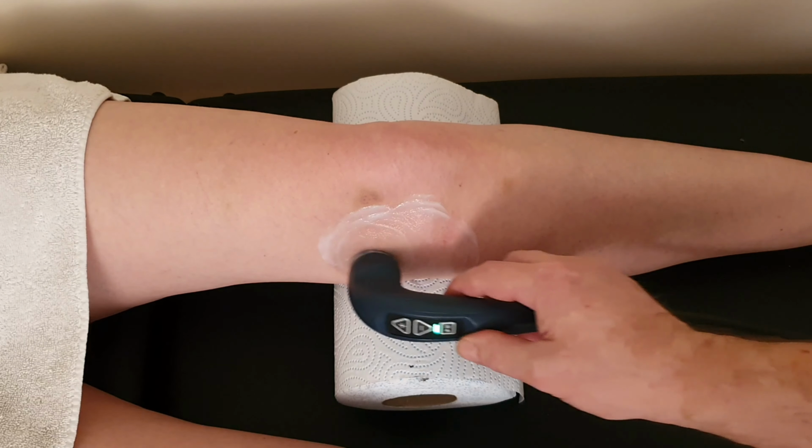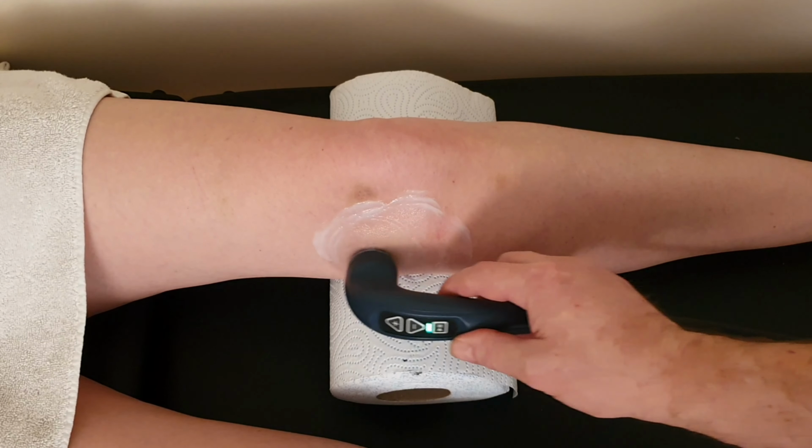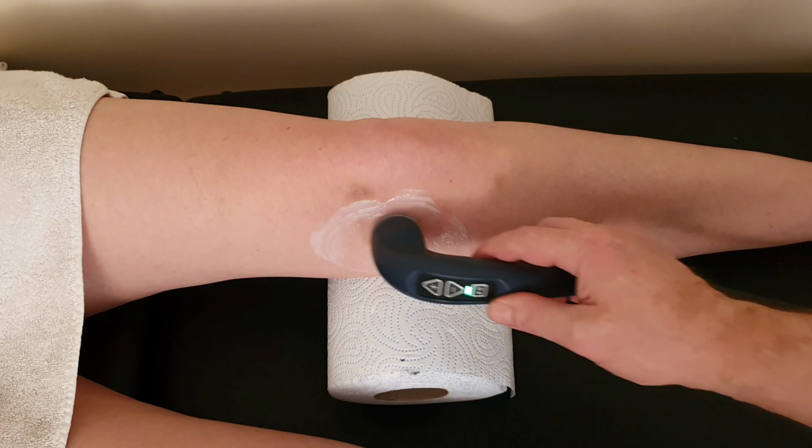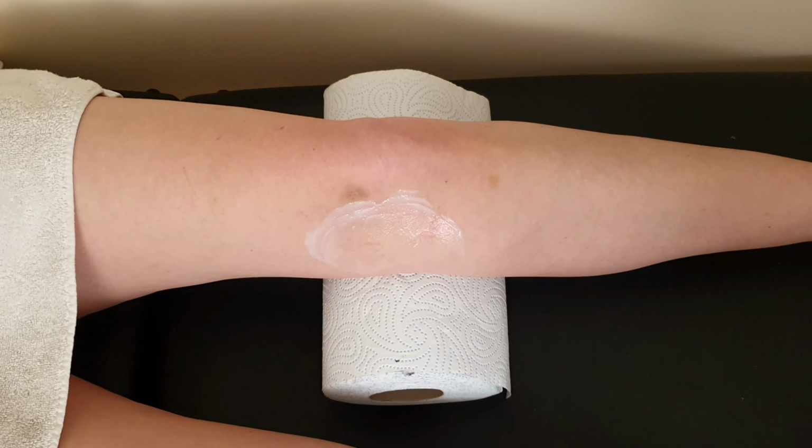I'm going to cut to the end of this treatment because this is a long treatment. We're going to be sat here for 3 minutes otherwise, and we'll see what the heat looks like at the end. I expect this will have changed quite dramatically, to be honest. A good treatment in chronic conditions.